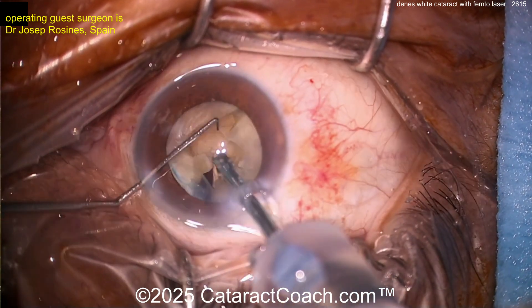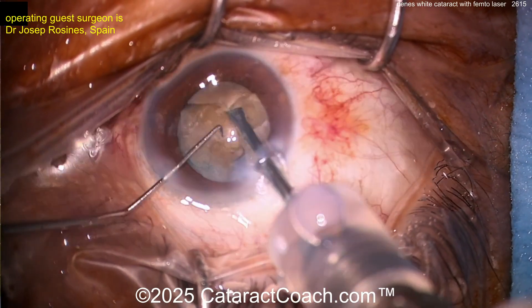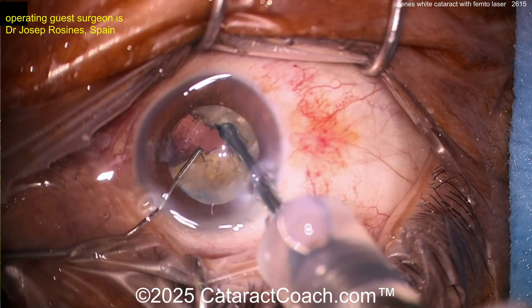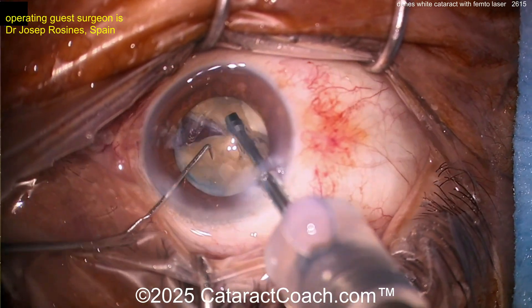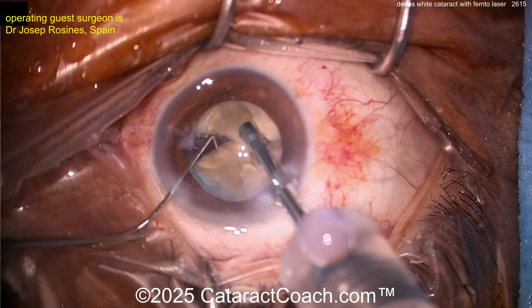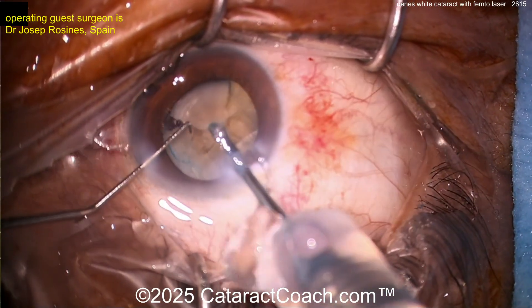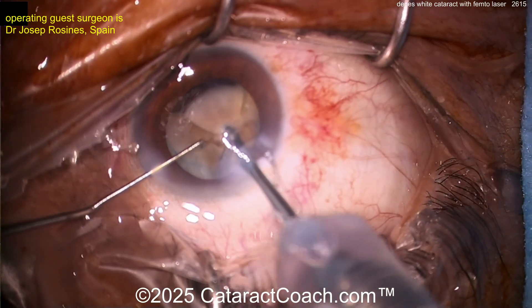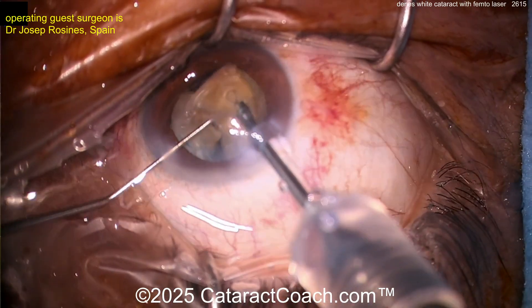At this point we can do some chop — make sure the halves are split a little bit further. There's a good chop, a little vertical chop, and another chop — beautiful, good technique here. Rotate, another chop. Sometimes it's so much fun to chop you just get carried away, but you want to get the first piece out and give yourself a little more room.